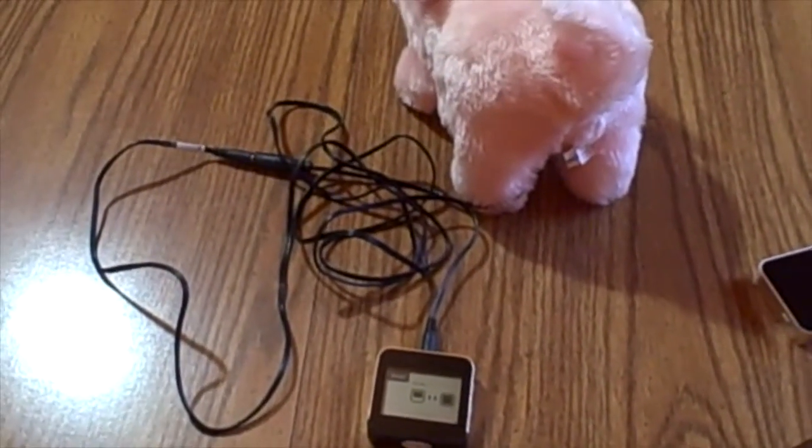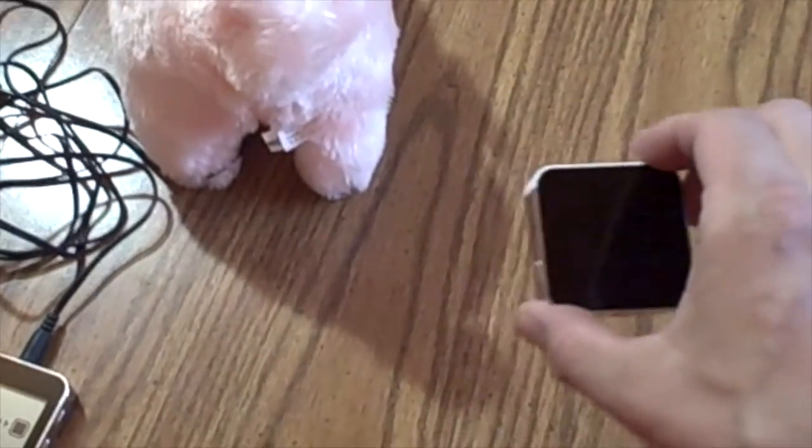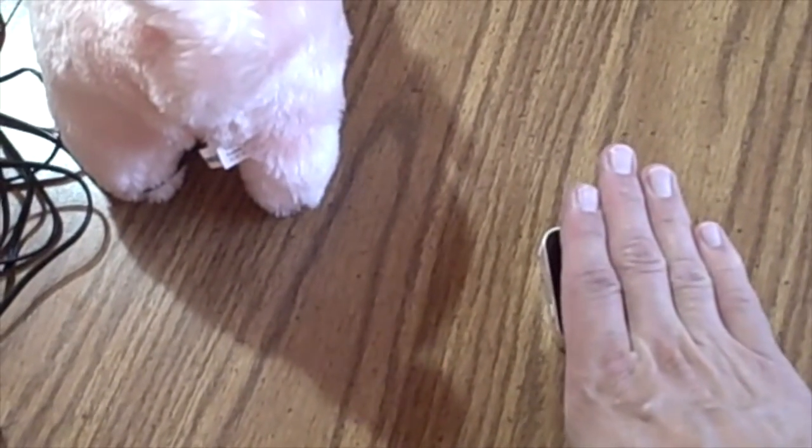The mini beamer receiver is hooked up to the pig, and the mini beamer transmitter can be set anywhere across the room. So it's like the candy corn, it's a proximity switch, or the child can touch it for direct selection.